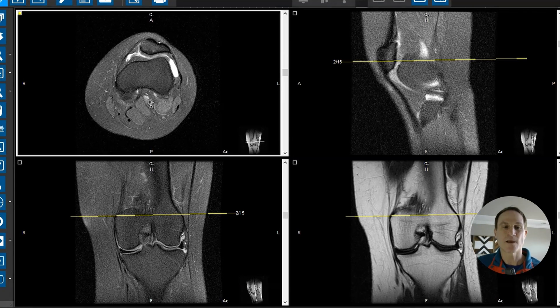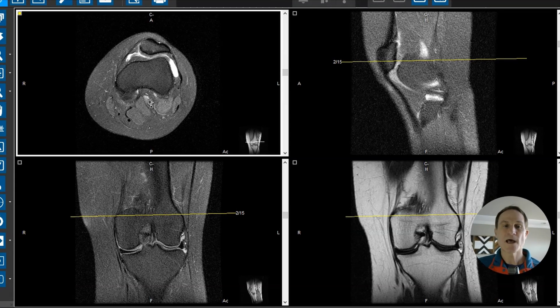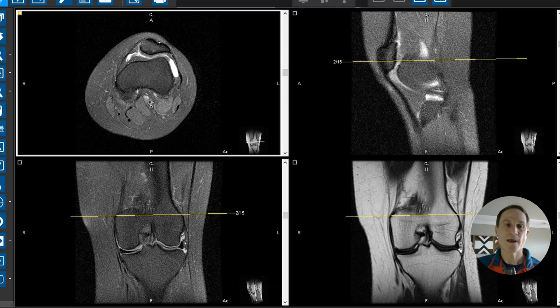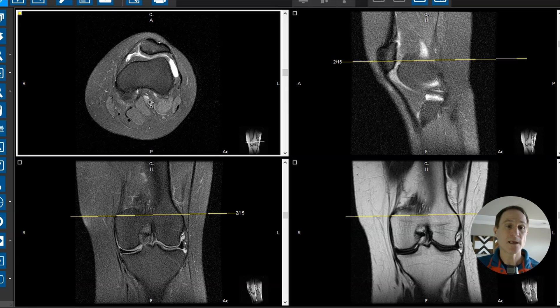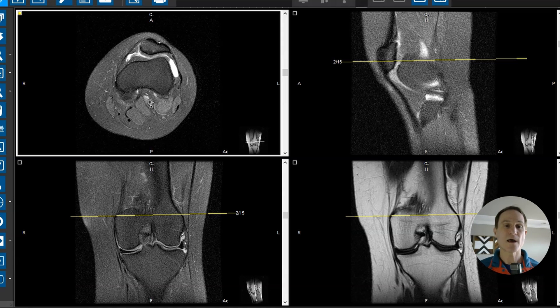Hello, this is Dr. Gay from First Select MRI, and this is a 29-year-old female who complains of knee pain. She has not had any prior injury, just pain in the knee, so she went to her doctor and they ordered this MRI of her left knee joint.